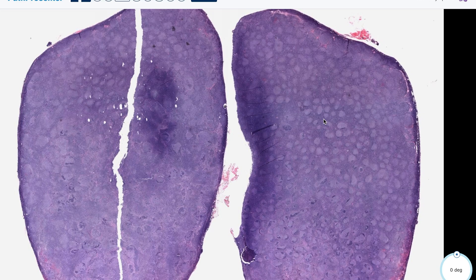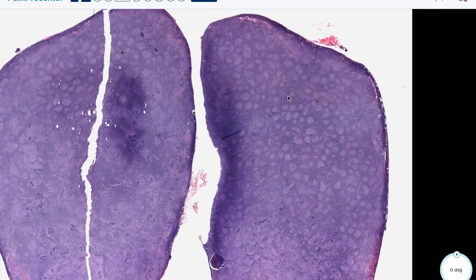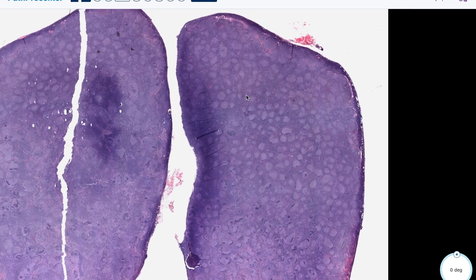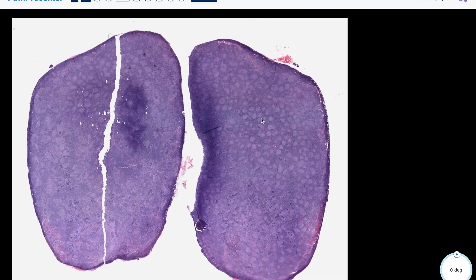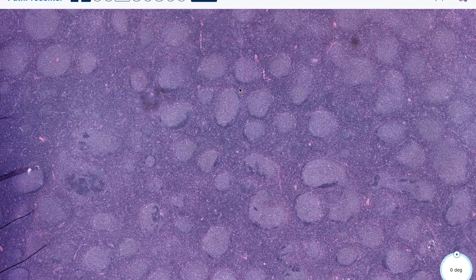In rare cases with an entirely diffuse growth pattern, the neoplastic cells should still show germinal center B cell morphology and immunophenotype. The fact that these are germinal center B cells is going to be important for immunophenotyping.